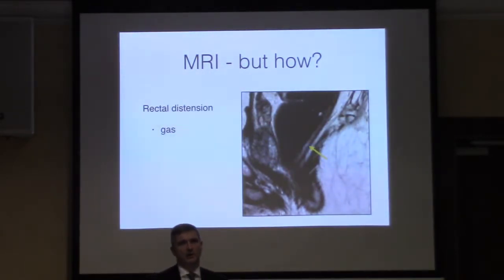And these are, I haven't chosen my best cases. These are just cases that come through our scanner. I've chosen most of the pictures from the last 2 or 3 weeks, because I'm slightly badly organised, from our local cases. So this is what you should be doing all the time. You should be able to get this kind of standard in most of your patients.